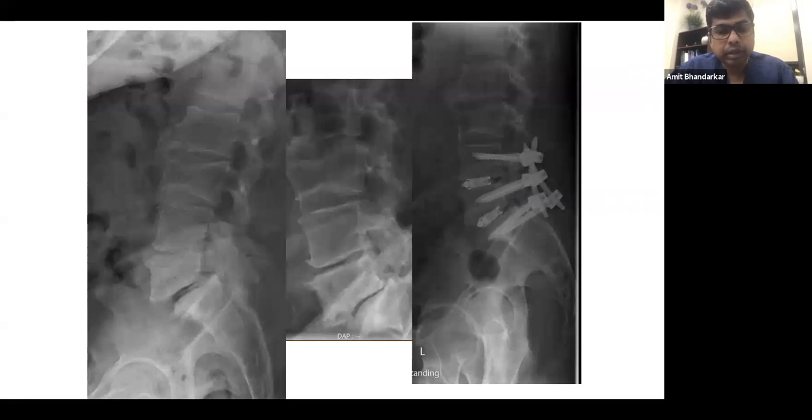A similar example here, but with extreme severe spondylolisthesis, long time neglected, almost no room for the foramen here. And I really wanted him to have some lordosis. I went ahead and did an open surgery on him, with bilateral facetectomy. Again, the window was very small. The exiting nerve root is right here. I cannot use a bigger cage. So this came to my rescue, and also created lordosis. I think this is one of the advantages of lordotic cages.